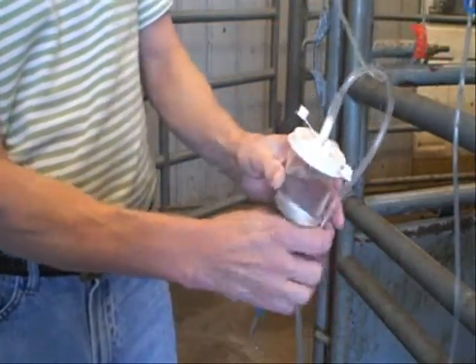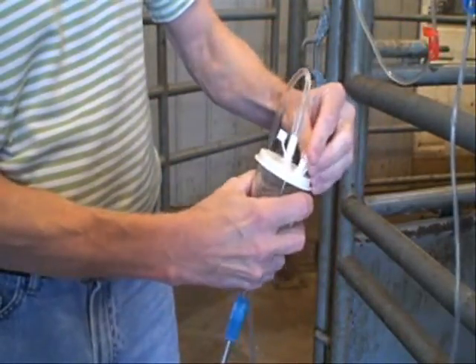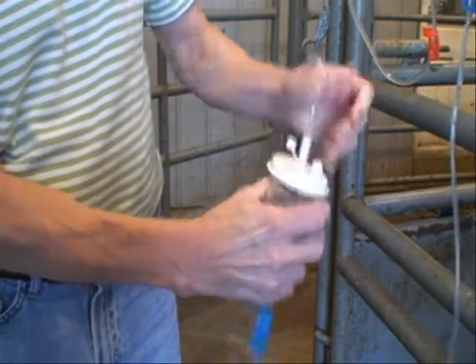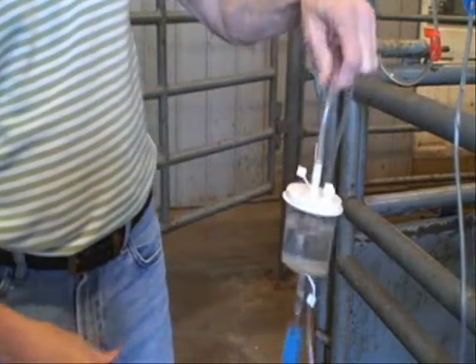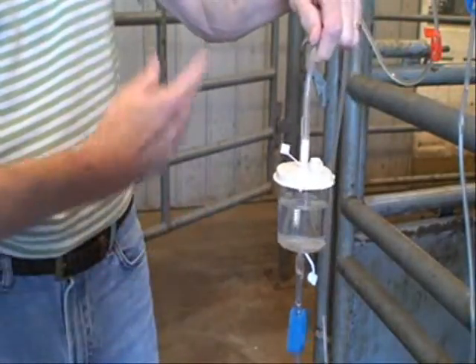Stop that. Reach over and close the air vent. Open the bottom clamp and it will maintain the liquid. You're ready to go flush.